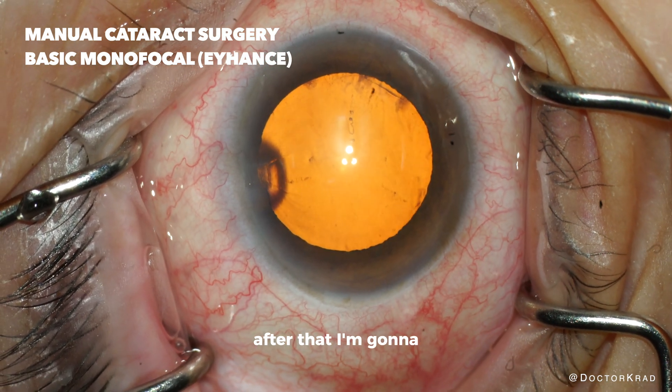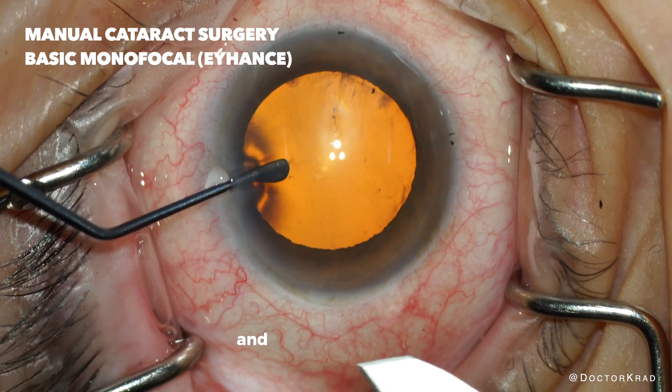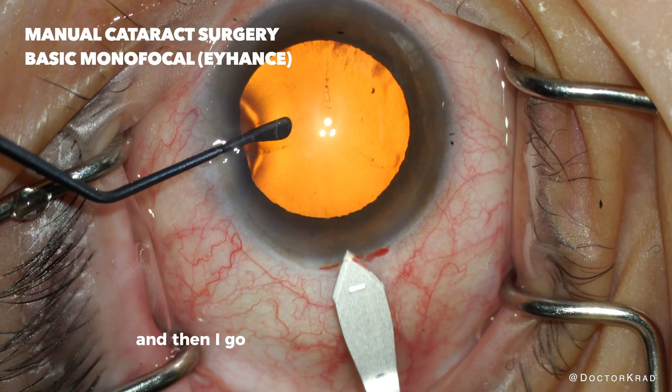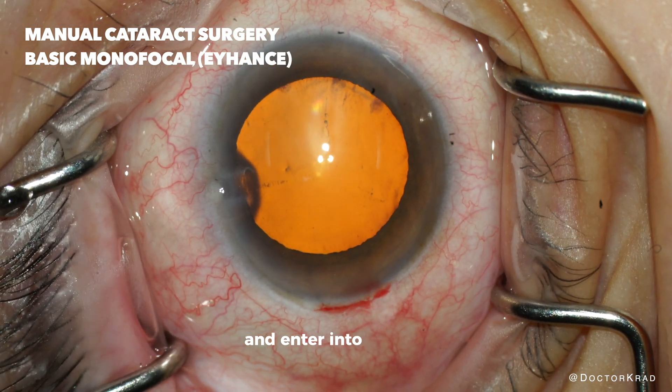After that I'm going to stabilize the eye with the instrument on the left and use a 2.4 millimeter blade to create a three plane incision. So I create a groove and then I go into the groove and then tilt down and enter into the eye.